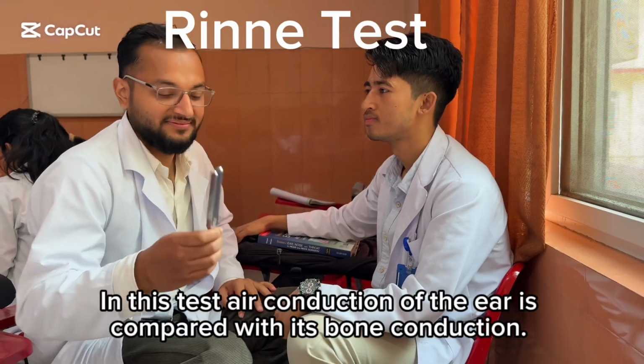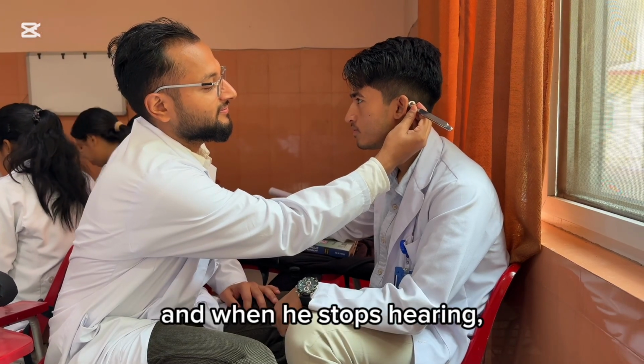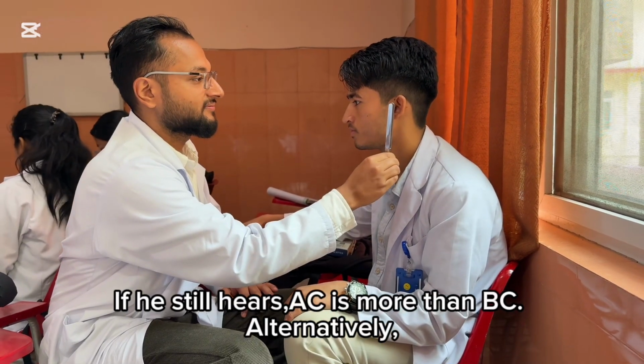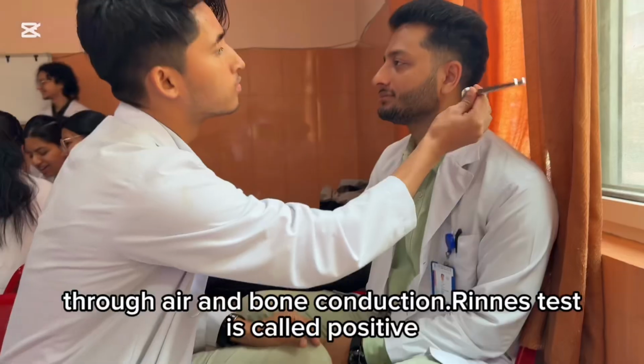In this test, air conduction of the ear is compared with its bone conduction. A vibrating tuning fork is placed on the patient's mastoid, and when he stops hearing, it is brought beside the meatus. If he still hears, AC is more than BC. Alternatively, the patient is asked to compare the loudness of the sound heard through air and bone conduction. Rinne's test is called positive.